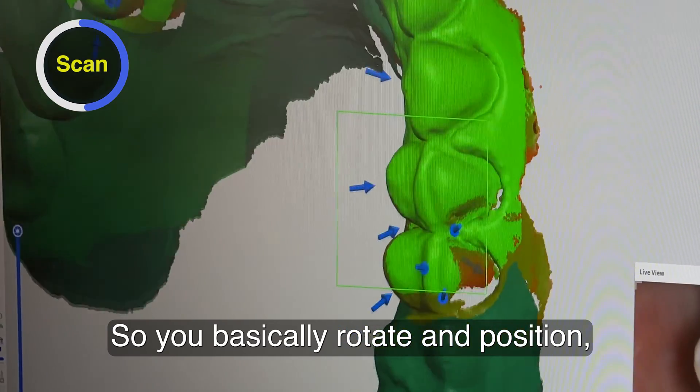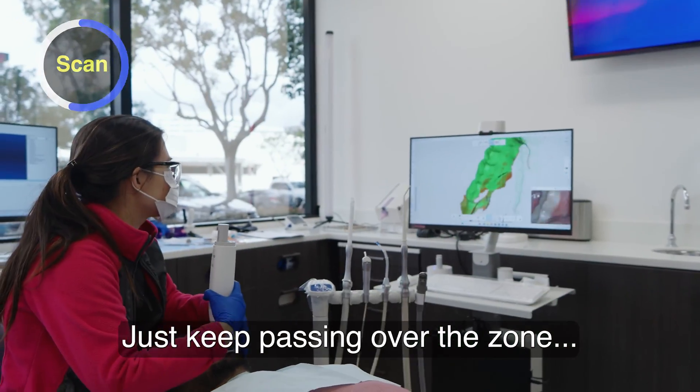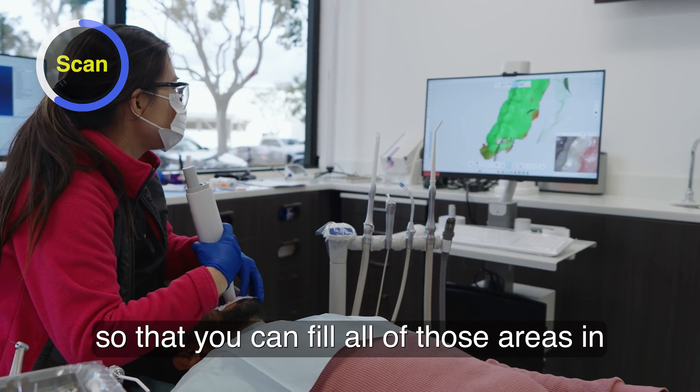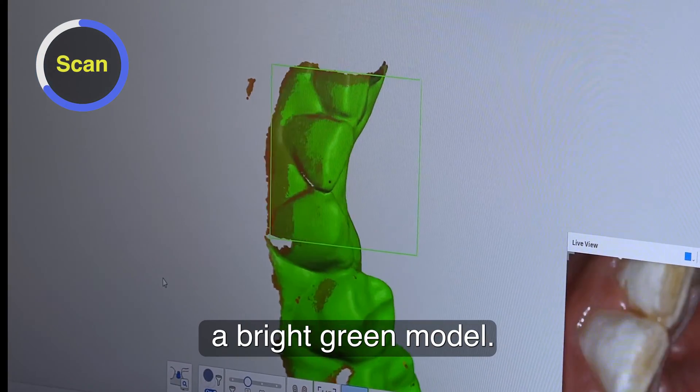So you basically rotate in position. You see red and orange is like low data. Just keep passing over the zone and rotate enough so that you can fill all of those areas in and convert the model into a bright green model.